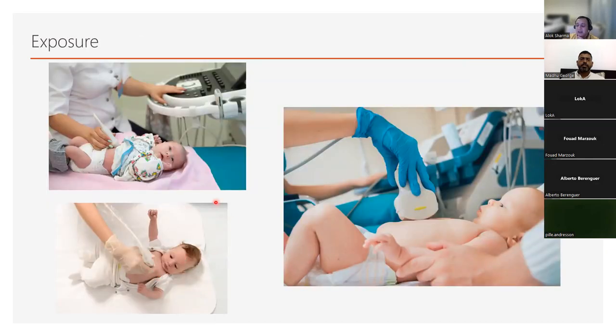So just another simple example that I'll give you here is if you want to go into the anterior and lateral regions alone, and you're scanning for a pneumothorax, you'd still need to expose this baby. Really getting into the upper axilla here to look for the regions which are R3, R4, and L3, L4 will be very difficult with the way this baby is exposed. You need to have good full exposure.